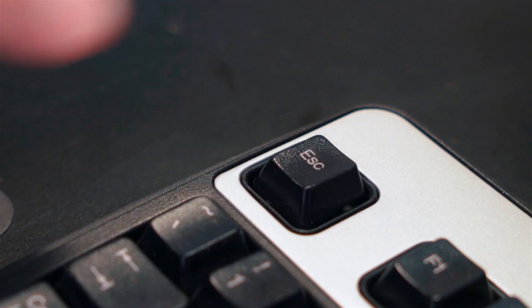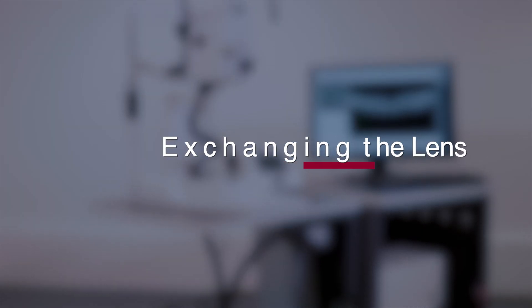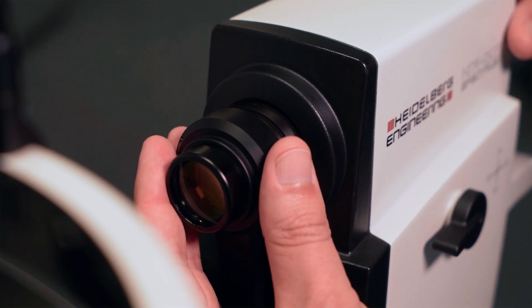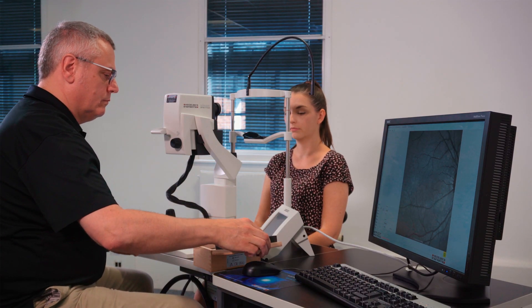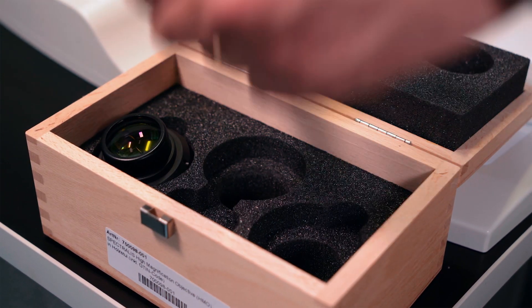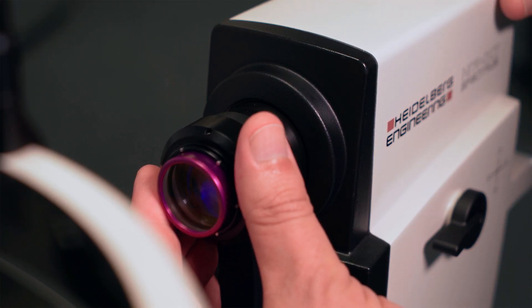Exit and save the images. Exchanging the lens: the 30 degree objective lens is removed using a counter-clockwise rotation. The high magnification module lens is selected, aligned using the red reference mark, and mounted with a clockwise rotation.